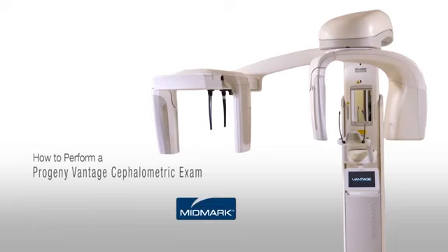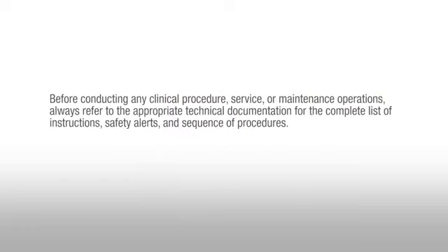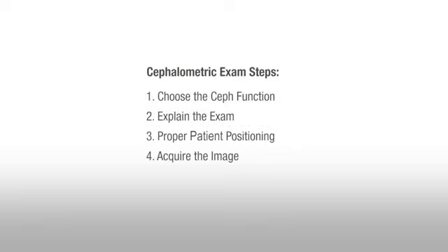This video will show you how to perform a Progeny Vantage panoramic cephalometric exam. Before conducting any clinical procedure, service, or maintenance operations, always refer to the appropriate technical documentation for the complete list of instructions, safety alerts, and sequence of procedures. The following steps will be covered in this video.